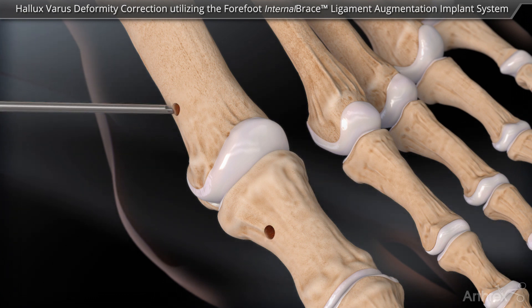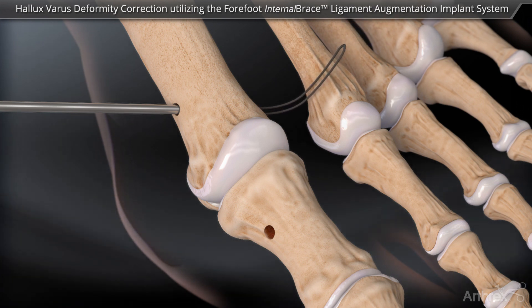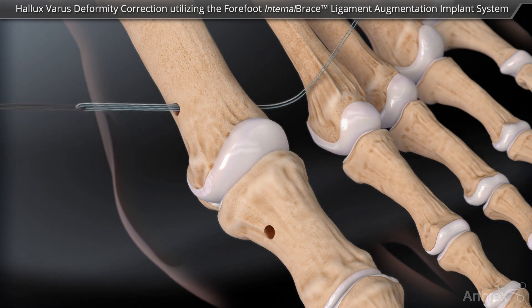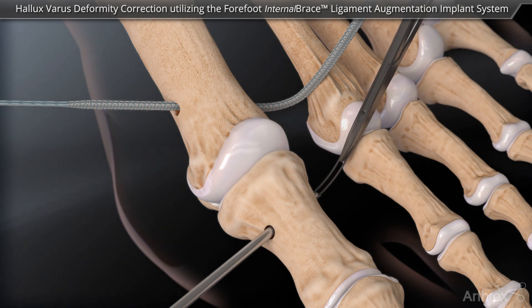A microsuture lasso with a nitinol suture passing wire is advanced into the first metatarsal drill tunnel. The fiber tape is passed lateral to medial through the drill tunnel. This step is repeated by passing the fiber tape through the drill tunnel in the proximal phalanx.